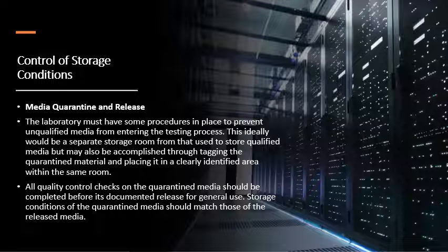So for control of storage, the lab needs a system to keep untested media separate from tested media to avoid contamination. Ideally, a dedicated storage room should exist with clear marking and storing of quarantine media within the same room. This is an acceptable pattern in every microbiology lab.